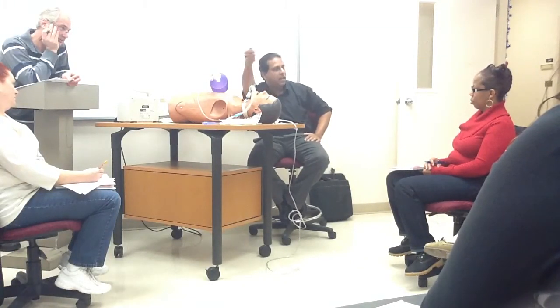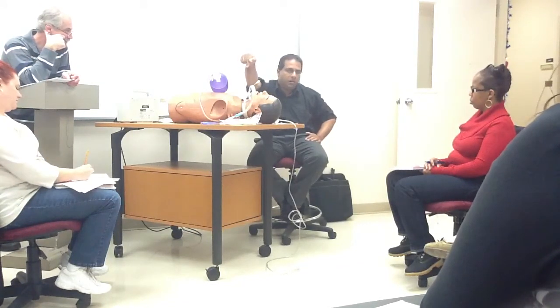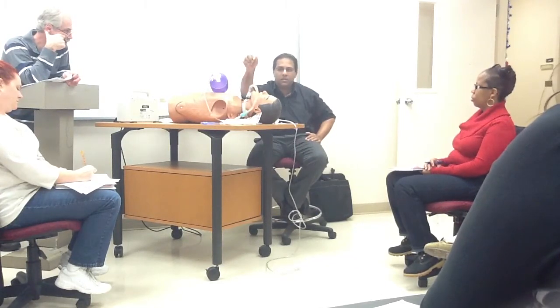They'll say okay. Then we just turn that FiO2 up to 98% and ask them to take deep breaths for about a minute or so. Then go suction. If they're on a ventilator, just turn the oxygen up. Yeah, you push the 100% button on the ventilator, and then suction. Then use the inline suction to suction.